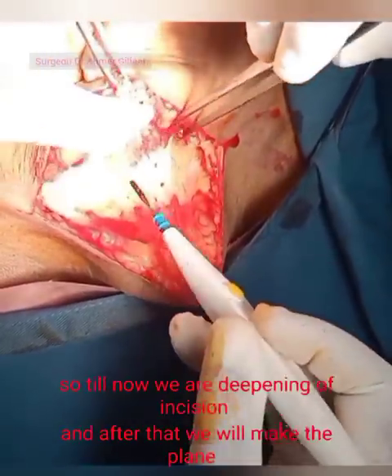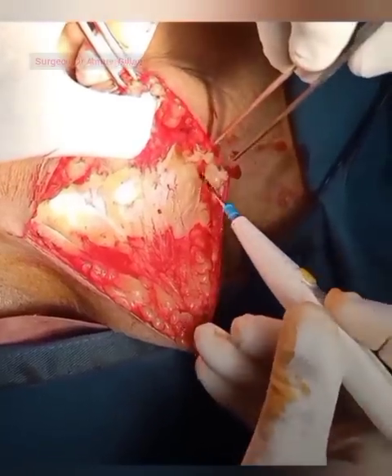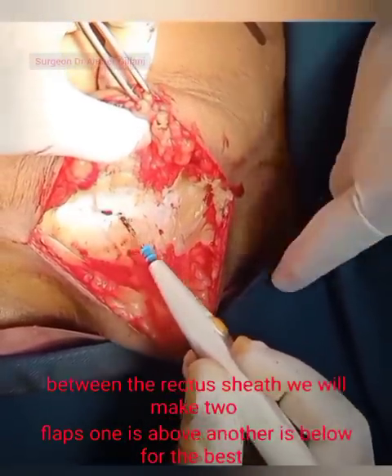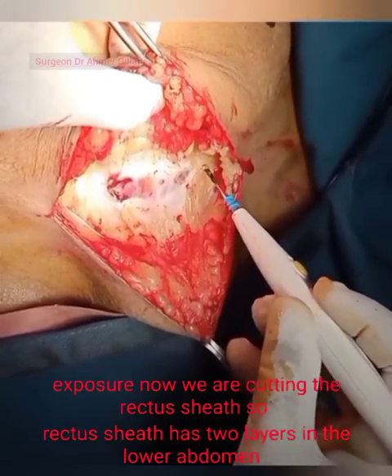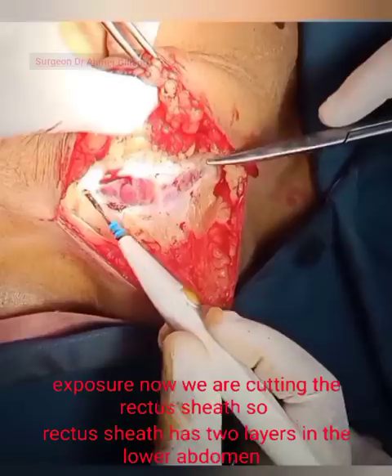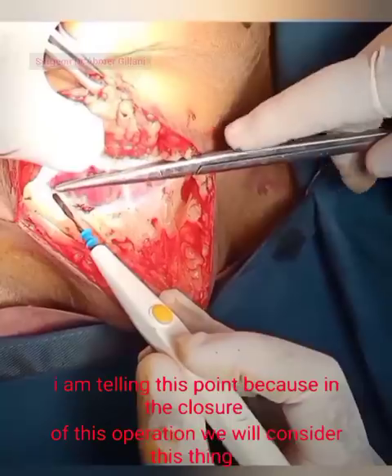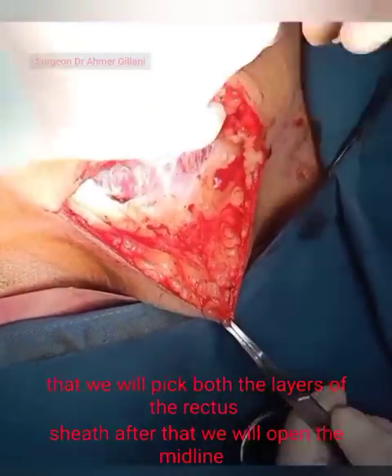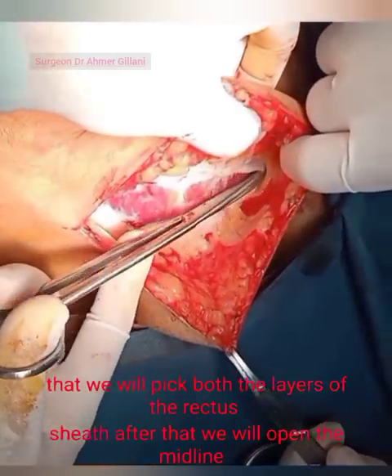We continue deepening the incision and then make a plane between the rectus sheath, creating two flaps — one above and one below — for the best exposure. Now we are cutting the rectus sheath, which has two layers in the lower abdomen. We will close both layers during wound closure. After that, we will open the midline.